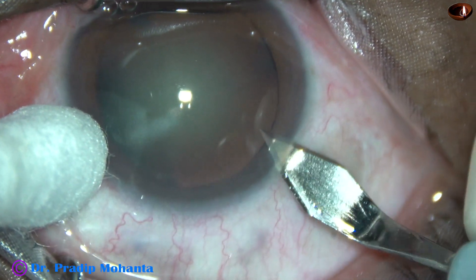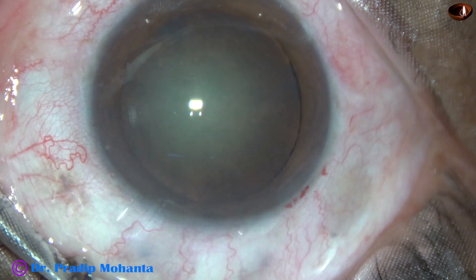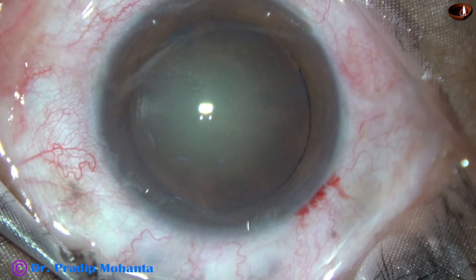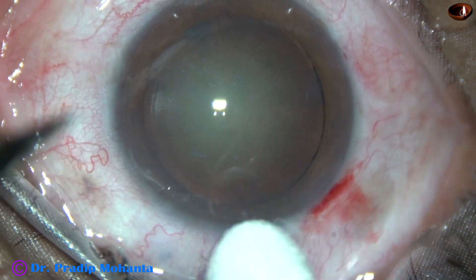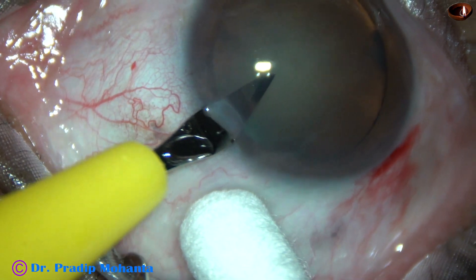This is the main incision with a 2.8 mm steel keratome. The patient is under topical anesthesia. This is a side port on the right side of the main incision, and this is another side port on the left side of the main incision.